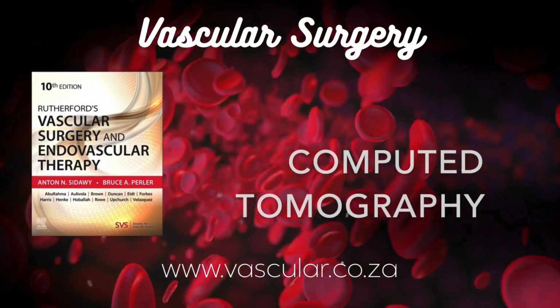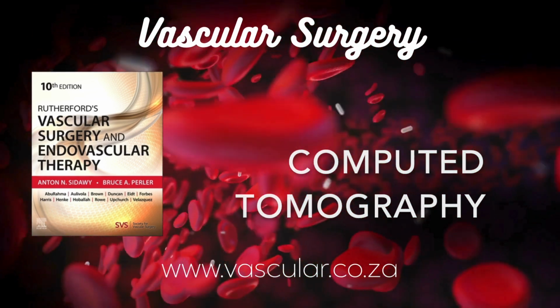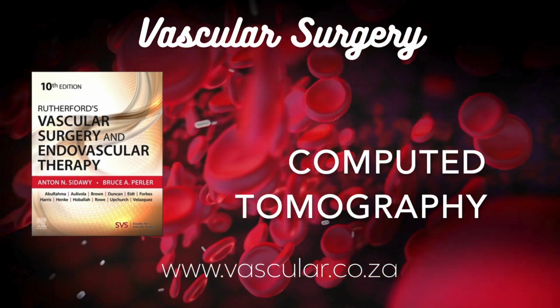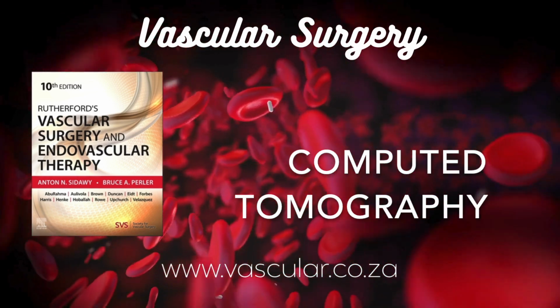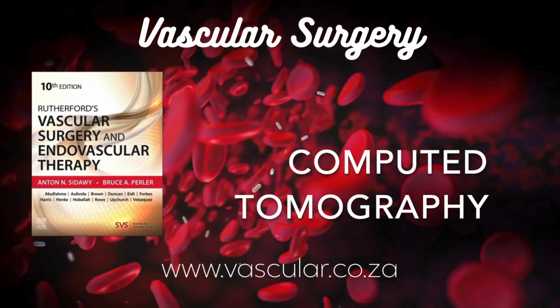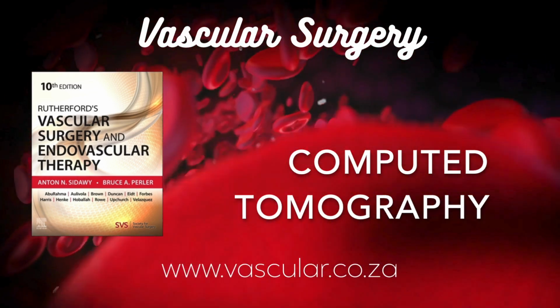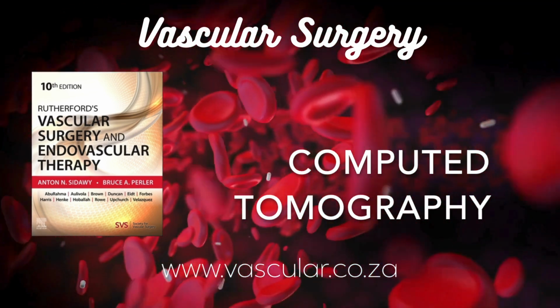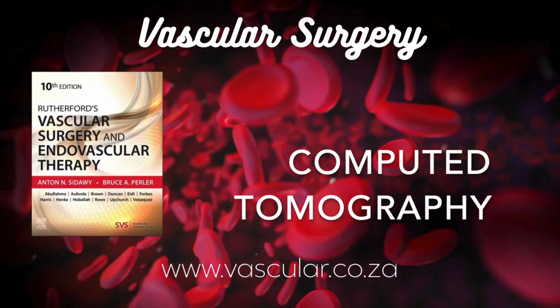They're often complementary. You mentioned fusion imaging. Yeah. And PET/CT. Fusion imaging is cool. It overlays the pre-op 3D CTA data onto the live X-ray image during surgery, uses bony landmarks to register them, helps guide wires and catheters in 3D, potentially reducing fluoro time, contrast dose, and procedure time.